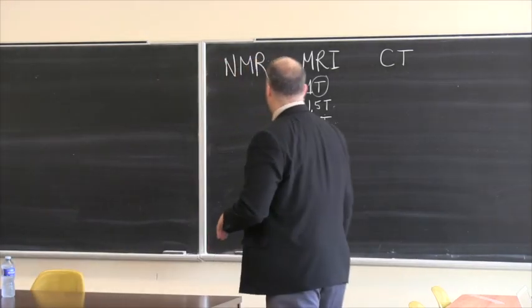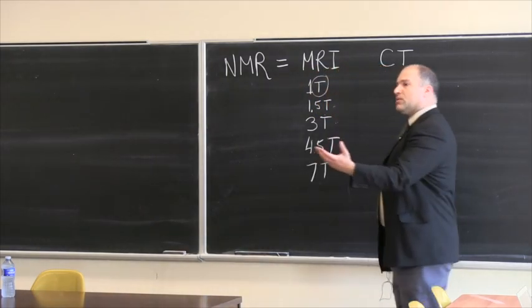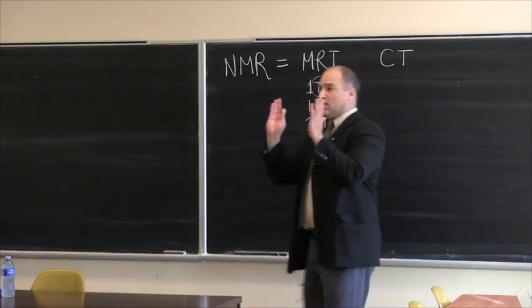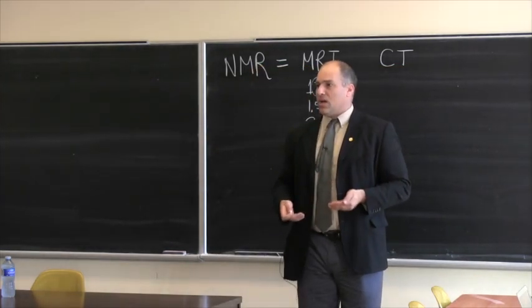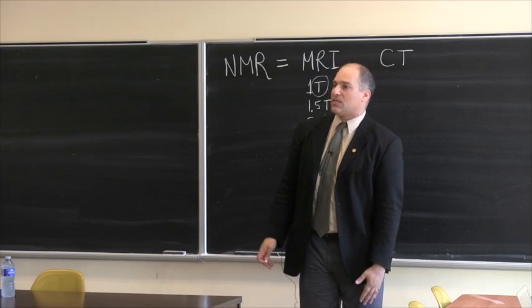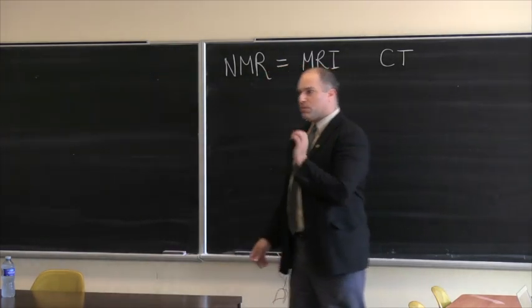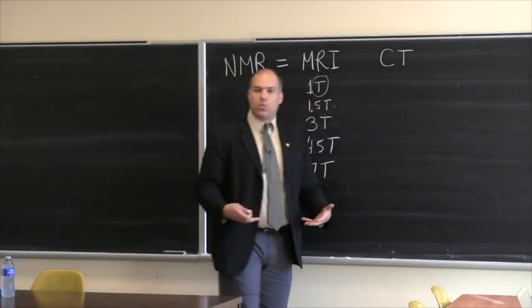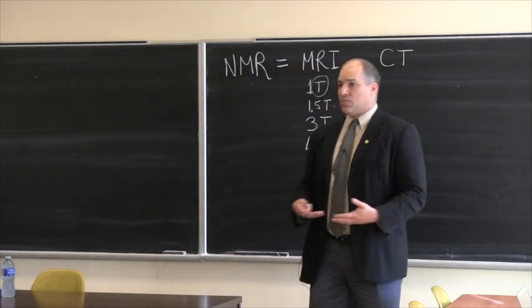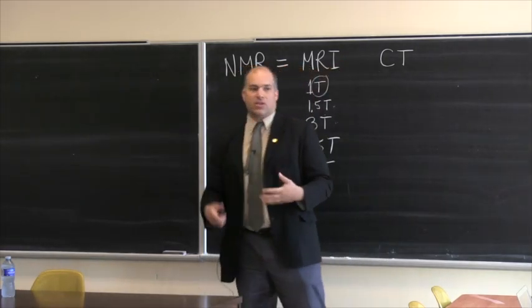Today, for clinical scans, so this is we're talking research, for clinical scans today, they have created vertical scanners. So today you have vertical scanners where you can actually stand up. You can stand up and you can get an MRI of the knee, for example, an MRI of your heart when you stand up. That's very important because posture changes many things. It changes the way that weight is distributed on your body. It changes the way that the bones touch, that ligaments are stretched, and so on.